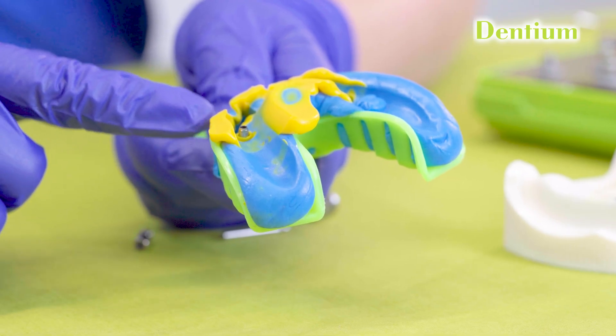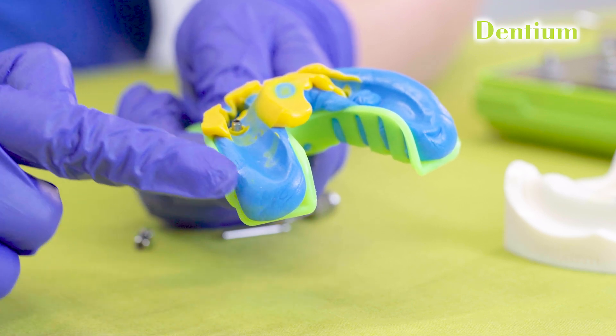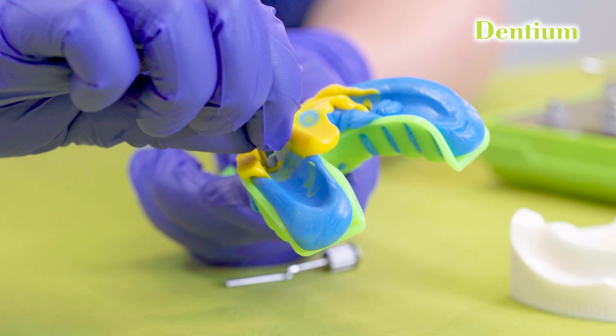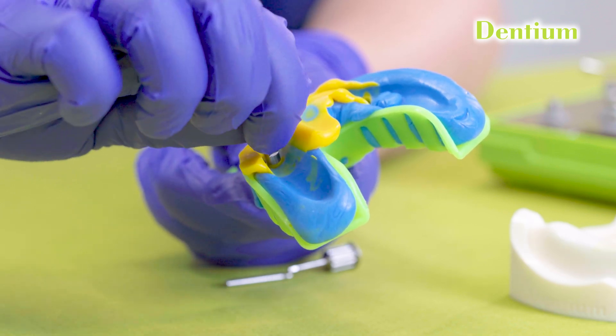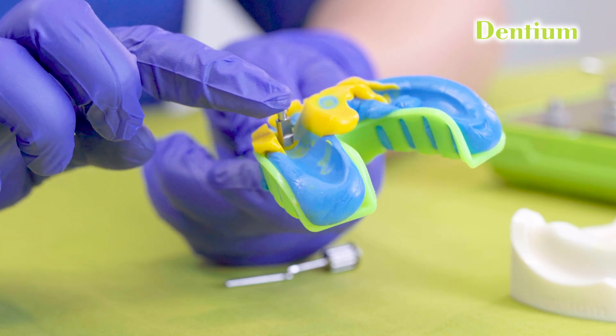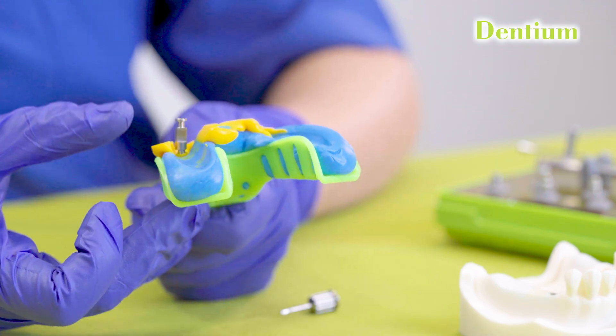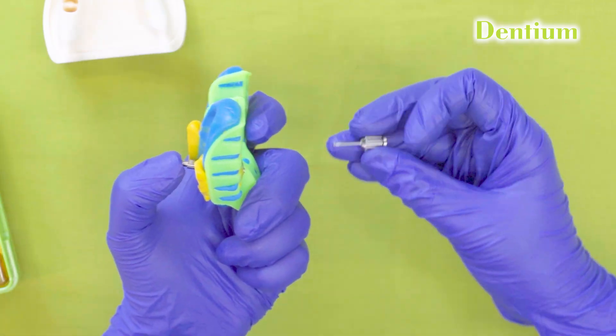Inspect the impression to confirm complete capture of the implant position and surrounding soft tissues. After this, fix the lab analogue over the impression coping by slightly twisting it so that the hex of the analogue engages with the hex of the impression coping, then tighten the screw with the hex driver. The gingival mask can be prepared either chairside or in the lab, whichever is convenient. It should cover 2 mm of the implant analogue surface. Finally, disinfect the impression following standard infection protocols and send it to the lab with a prescription including details such as shade selection.